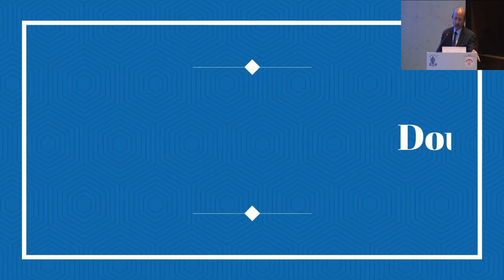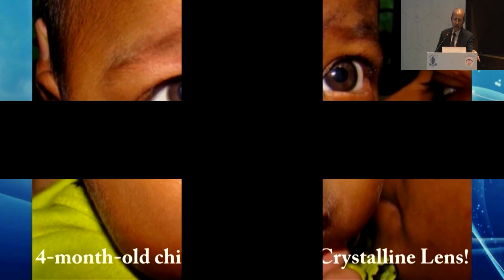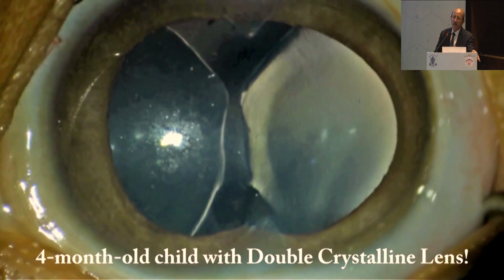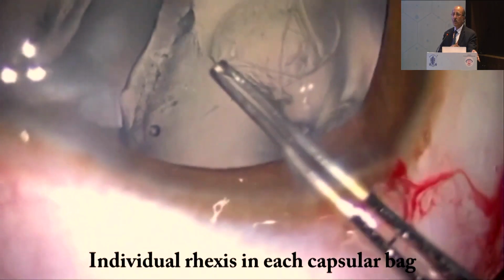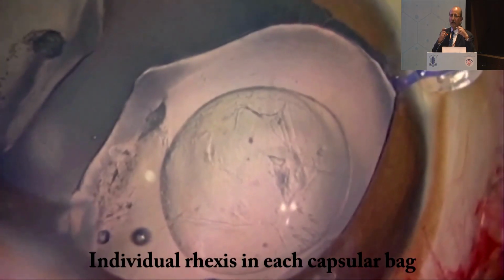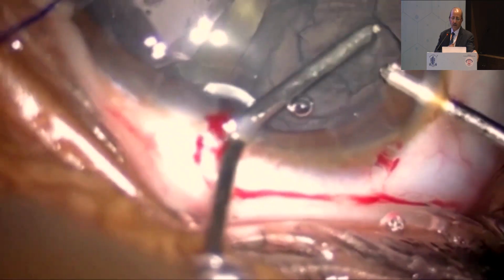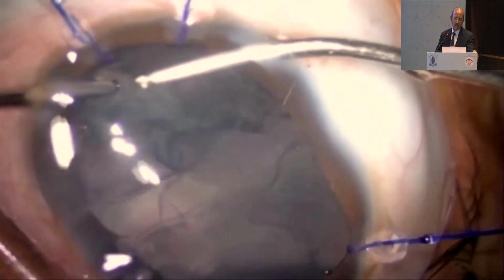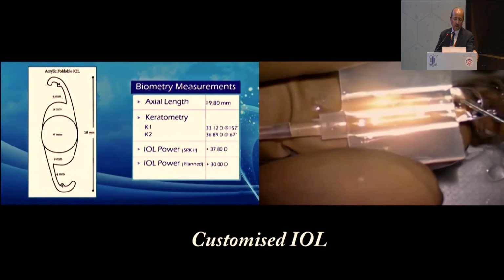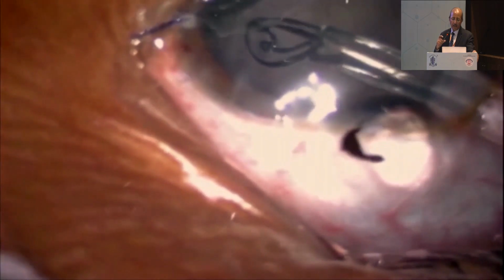This is anterior segment OCT also. So here this third child comes with double crystalline lens. I think you must have seen this video in many places. This is a child who had united corneas, two corneas joined together. There was a junction in the center, and there were two crystalline lenses. They were separate crystalline lenses, and we planned a customized IOL for this child. This was an 18mm long customized IOL which was made by Care Group.